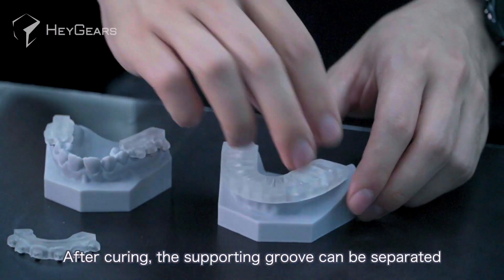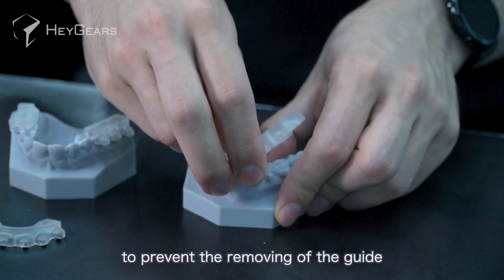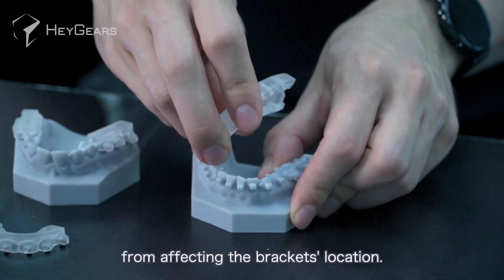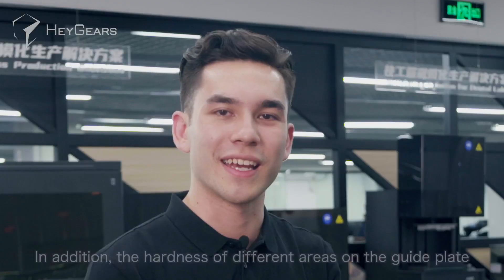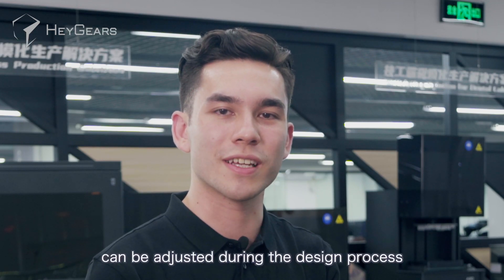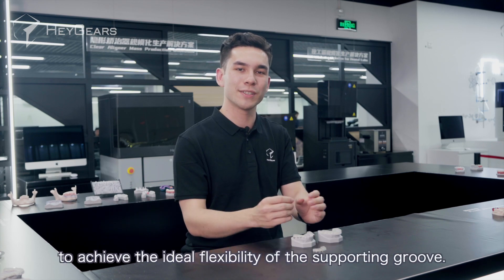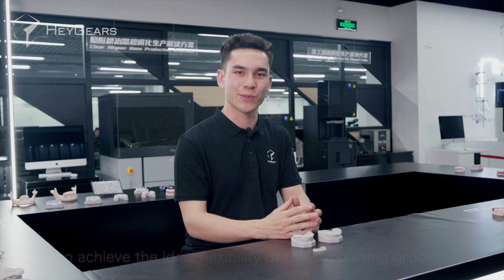After curing, the supporting groove can be separated one by one from the bracket to prevent the removing of the guide from affecting the bracket's location. In addition, the hardness of different areas on the guide plate can be adjusted during the design process by using different wall thicknesses to achieve the ideal flexibility of the supporting groove.